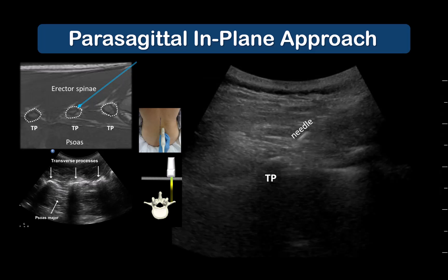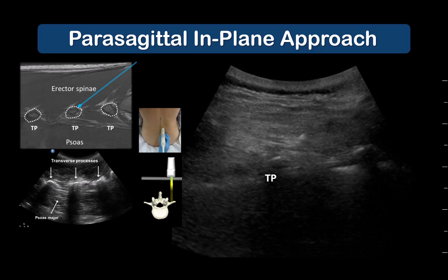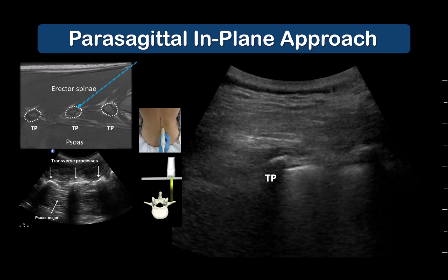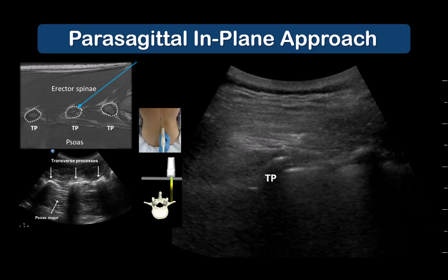Here is another example in which the target transverse process is T12 in a patient having a T12-L1 revision of their previous fusion. Again, the needle contacts the transverse process and local anesthetic is seen spreading in a cranial-caudal direction, creating a pocket that lifts the muscle up.